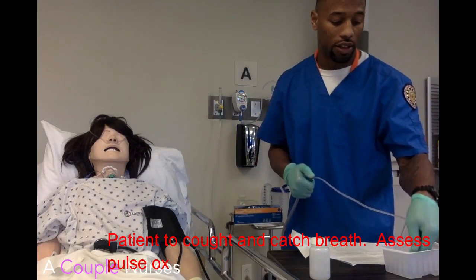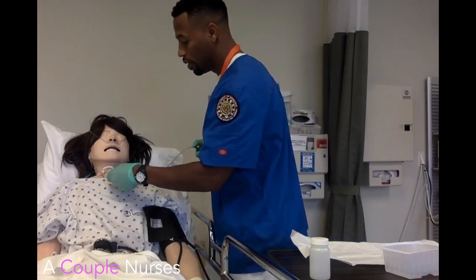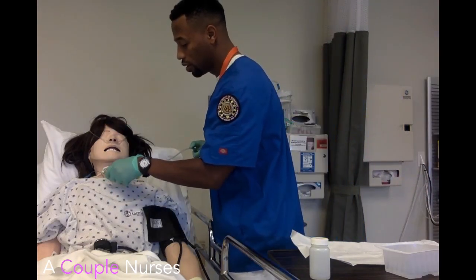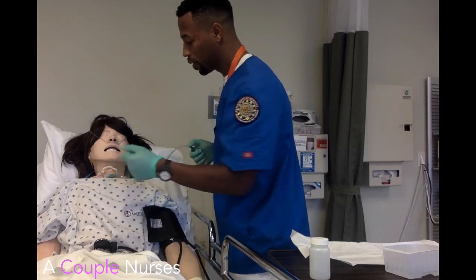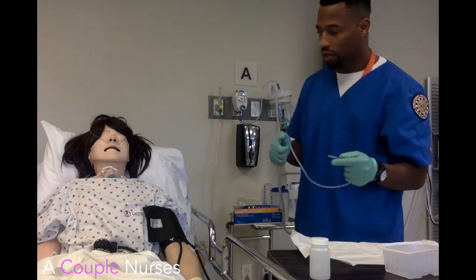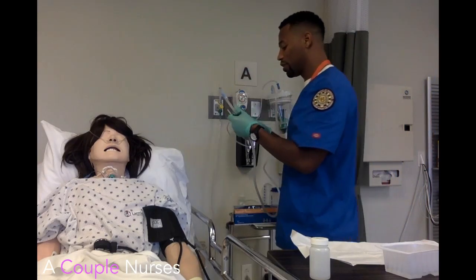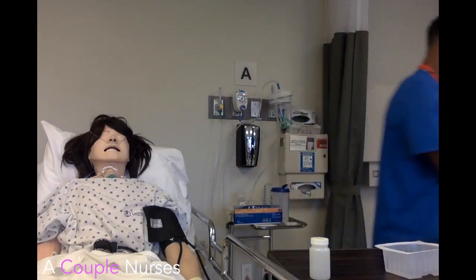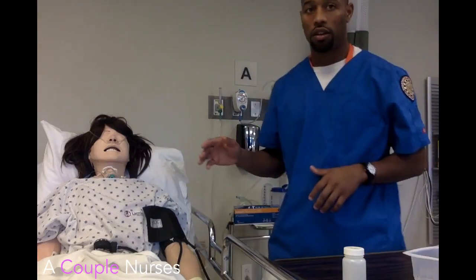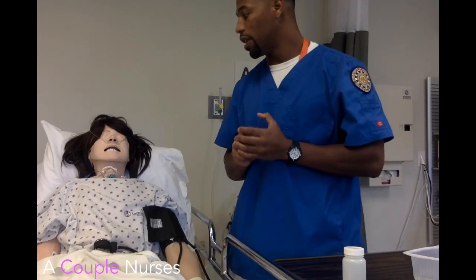If I believe suctioning is needed again, I'm going to confirm that suction is working and go in again. You're going to feel a little uncomfortable, okay? The patient is suctioned to the carina with intermittent suction on the way up. Both hands are now dirty. I stop my intermittent suctioning and all of this goes to the trash. Are you feeling okay? Wasn't too bad, was it? Earlier I would have also gotten the patient's O2 sat to monitor it.